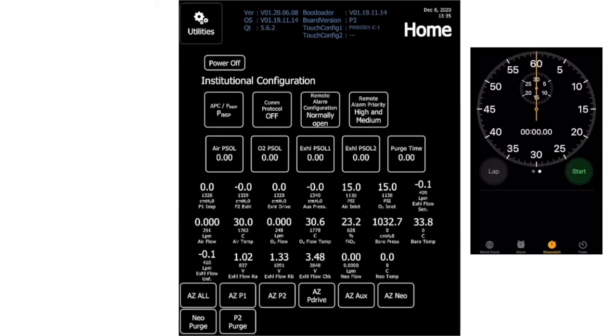I had a dirty pop-up valve, which I cleaned off. Let's see if that created a leak. So I'm going to do the test again. Now, this is both my inspiratory and expiratory side, my whole system. So I'm going to turn my airflow up again to 0.75 voltage. And this will create an airflow of approximately 3 liters per minute.